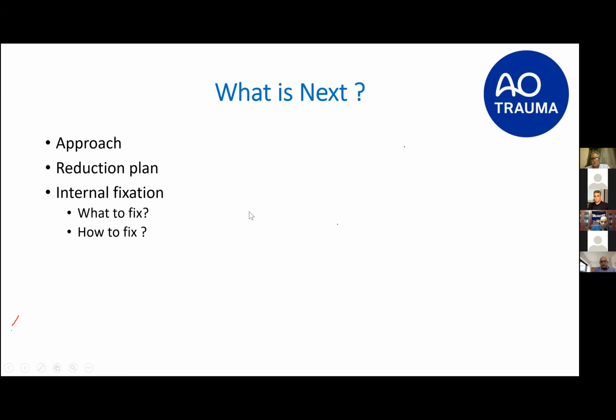As much as I can. So why do an extra step? Yes, as long as I am going to open it. In this particular case, there is a very evident impaction fracture on the anterolateral part of the tibial plafond.